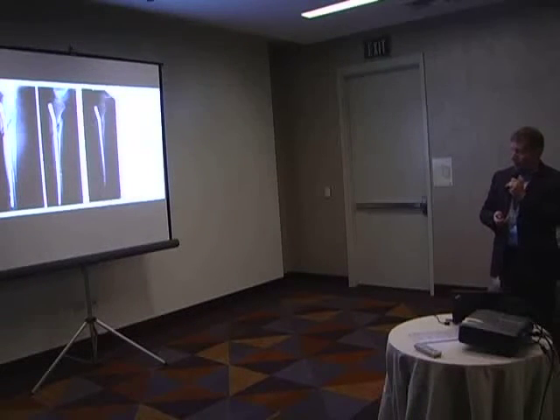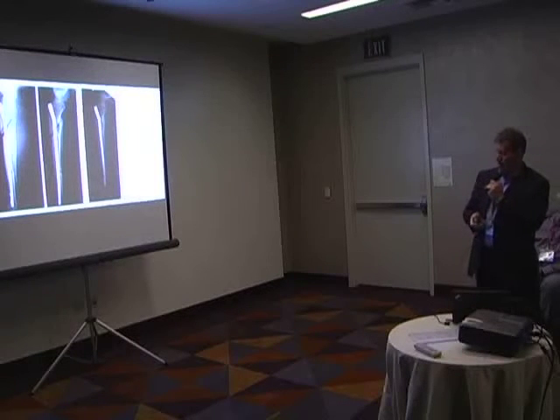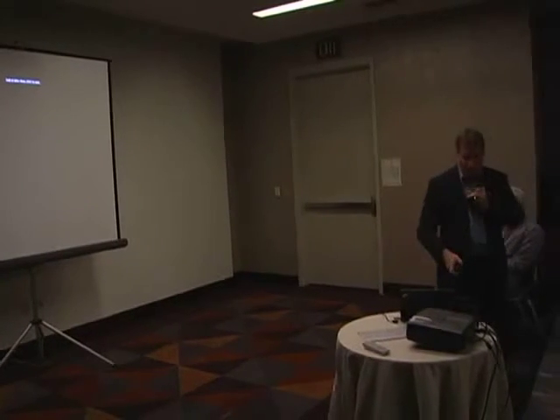And then at that particular point, treatment was initiated, and 5 months later, the patient had much more callus, including anteriorly, and more importantly, her symptoms had resolved and she was weight bearing comfortably. So again, just some examples.